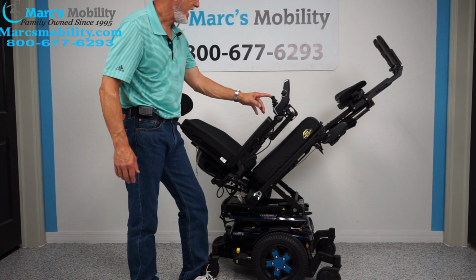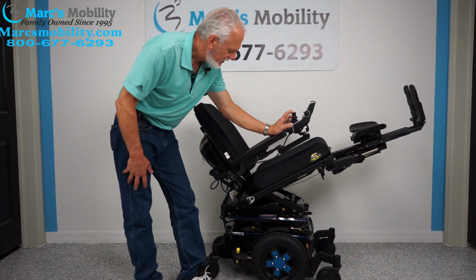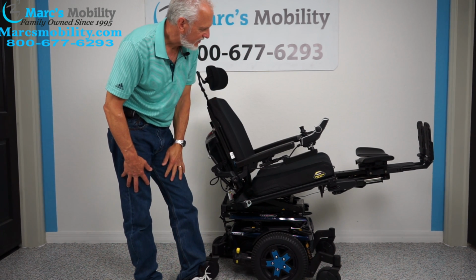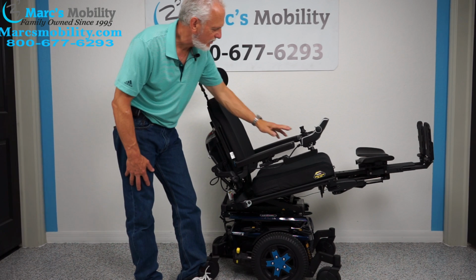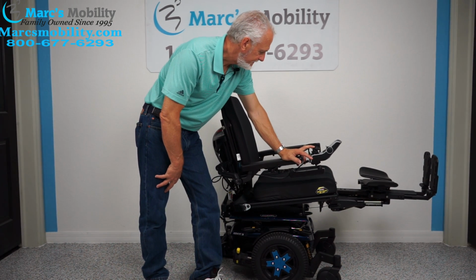But I'm going to bring the seat halfway down. And you can see halfway down that you still can do it with your feet higher. Right there, your feet are still technically higher than your body. So you would have some circulation there if that's what you need.